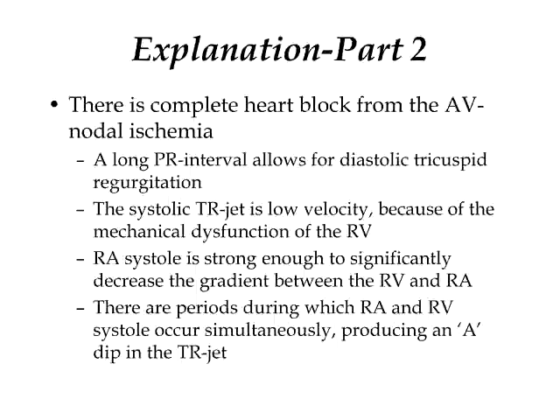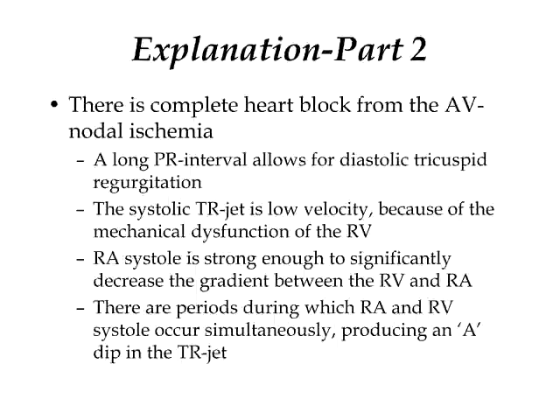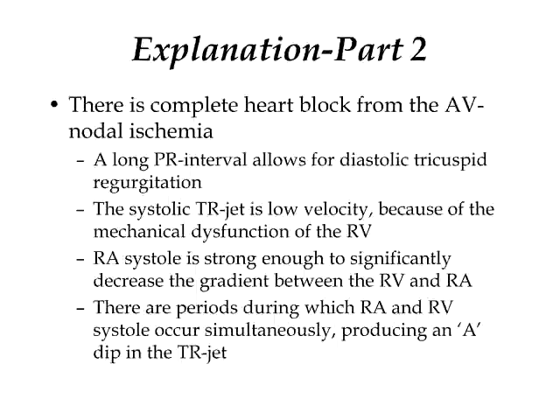He has long PR intervals frequently because he's in complete heart block, which allow for diastolic tricuspid regurgitation. That happens because the TR is being driven by right atrial relaxation in the absence of concomitant right ventricular systole — so that's a very low-velocity TR jet driven by RA diastole. However, the systolic TR jet is also low-velocity because of the mechanical dysfunction of the right ventricle.